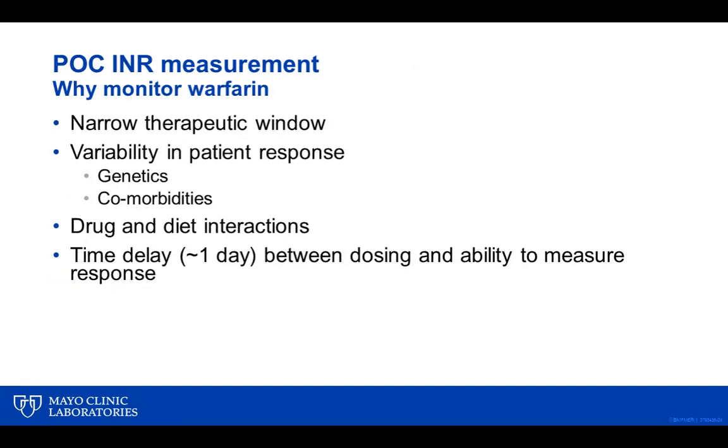So moving on to point-of-care INR measurement. That covers the use case for capillary glucose in patient self-management in the home, and in the hospital, with limitations of capillary measurement in critically ill patients. But what about point-of-care INR? Why monitor INR with capillary blood?